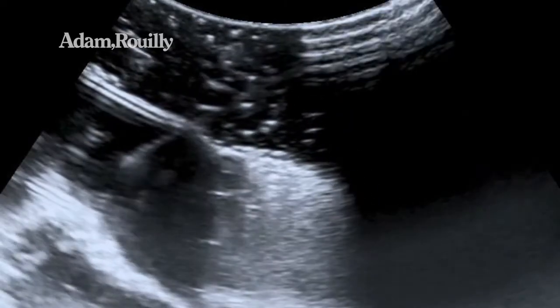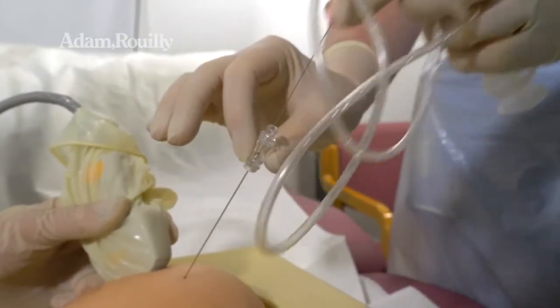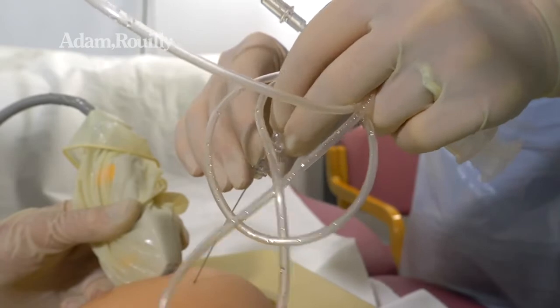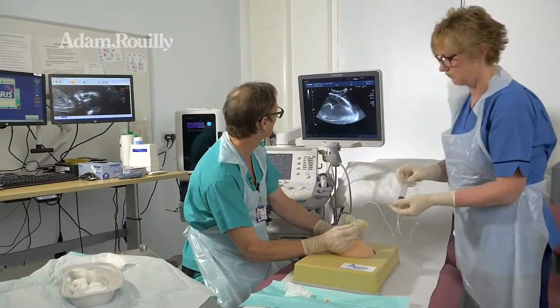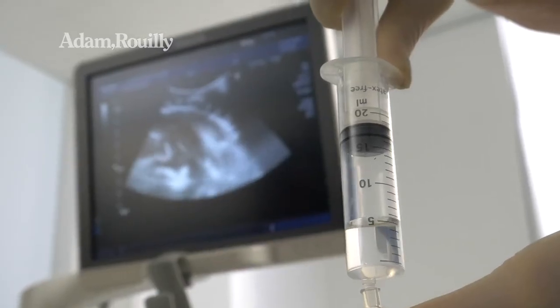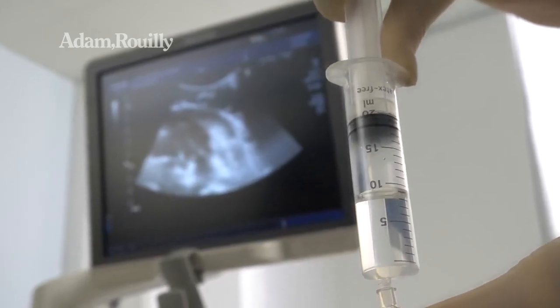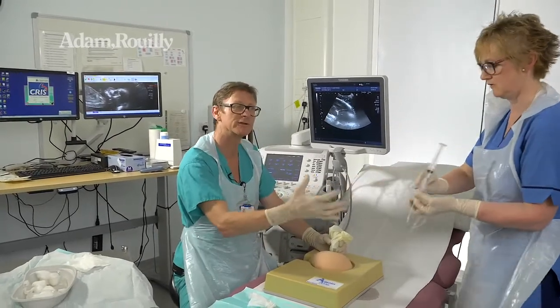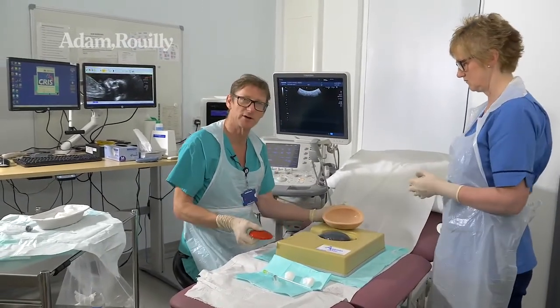We can just see the tip there. So we're in a nice pocket, and I now let go completely while Isabel connects the tubing up, and we use a short length of tubing that contains just 2 mils, and we harvest that 2 mils at the end simply so that there's no shake between me and Isabel. So I take that back. We watch the needle at all times, or you should have. And you can just see the tip is well clear there. And I don't look at all at what's going on now, and Isabel tells me when we've taken our sample. Isabel applies a tiny bit of positive pressure to stop us sucking up maternal sample into there and contaminating it, and there we've finished.